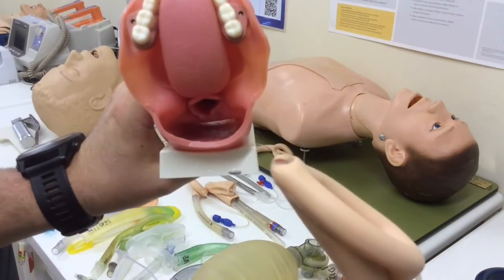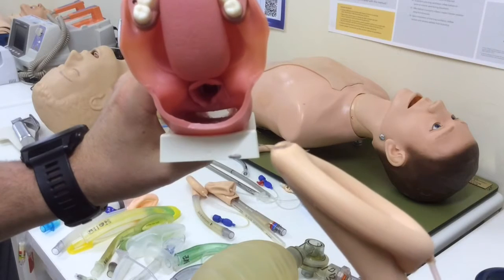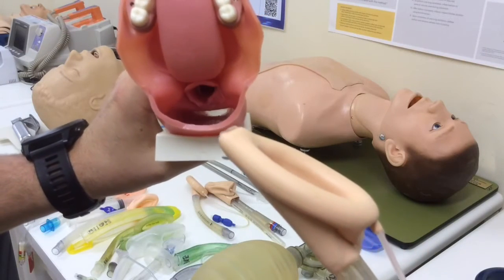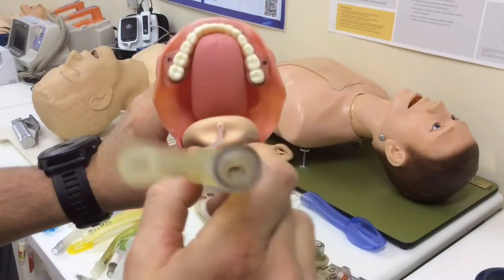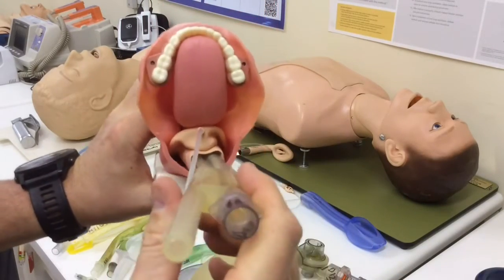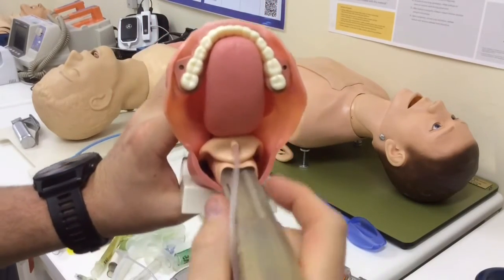So you recognize that when you're inserting an LMA, the principle is that the very tip of the LMA should be sitting posterior to the arytenoid cartilages in the proximal portion of the esophagus, sitting down like this, with the posterior cuff sealing at the base of the tongue.